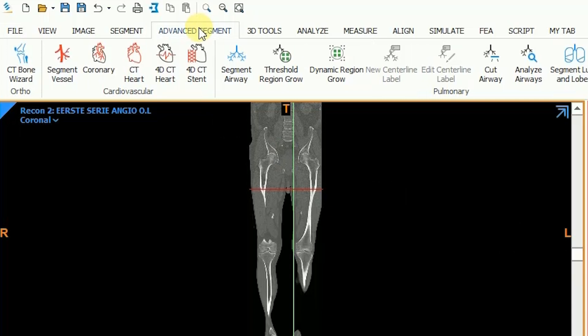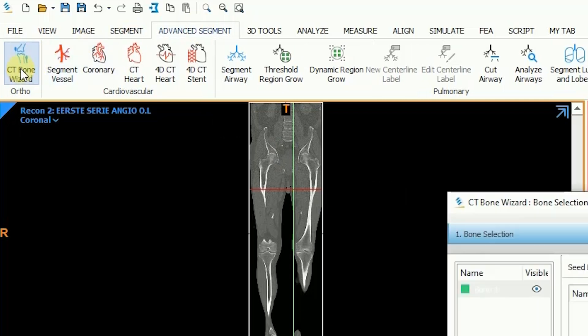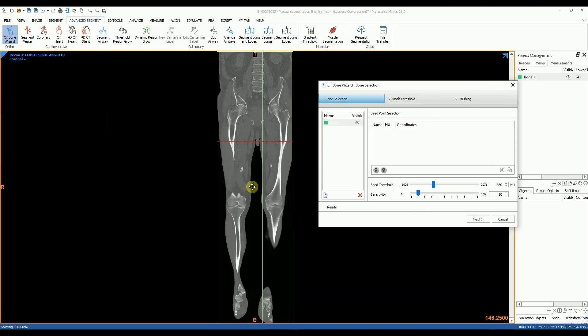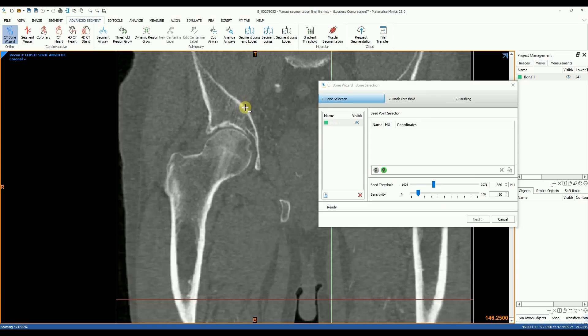Using the same data set I'll show you a second approach that requires a bit less manual work and obtains similar results. For this I'm going to use the CT bone wizard, and as the name suggests this tool segments bones on CT images. We can find it under the advanced segment tab. The CT bone wizard works almost automatically with minor user input. After opening the tool we are prompted to select points in desired and undesired anatomical regions.